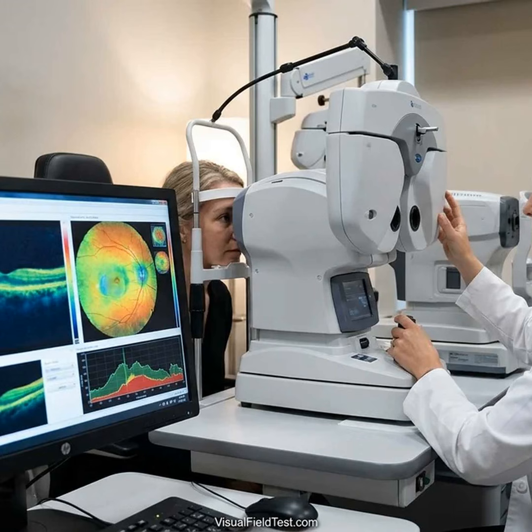Progression over time. Critically, OCT allows comparison of scans over months and years. The software can flag statistically significant thinning from one visit to the next. For example, a drop of 4 to 5 microns in average RNFL over a year can suggest real progression. Doctors often use guided progression tools in OCT to see if areas are getting thinner faster than normal aging.